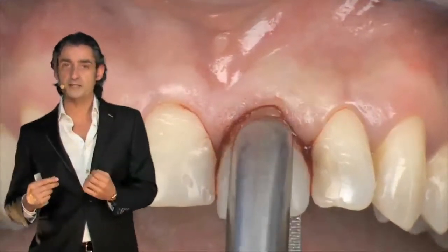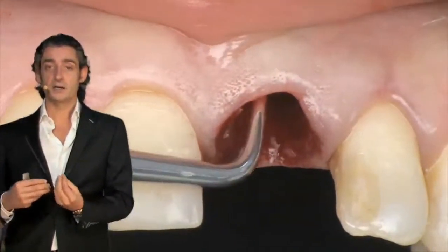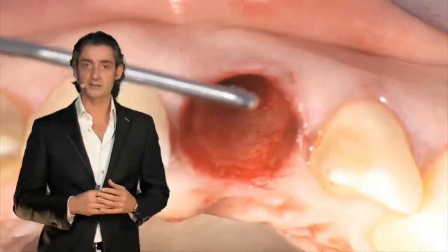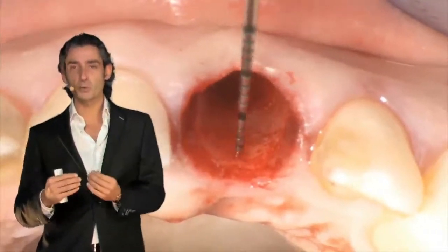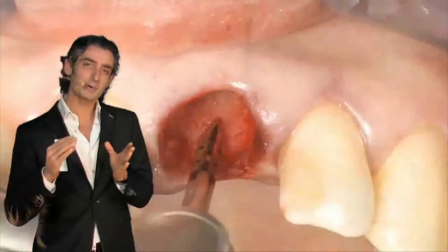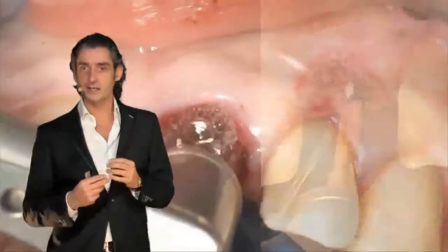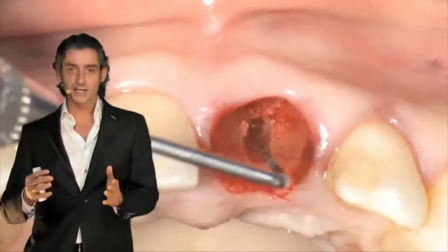We have to avoid pressing in the buccal direction, because we have to avoid the extraction of this tissue and the bone there. We have to clean a little bit just to avoid any kind of tissue inside. And here, look here. Right now I'm checking exactly where I will start with my precision drill, because the osteotomy will be done exactly on the palatal side, as I told you, just to avoid any kind of contact. But look here, especially with the second camera, we can understand how we get in on the palatal side, and then we can change the direction of the drill just to obtain a really nice insertion.